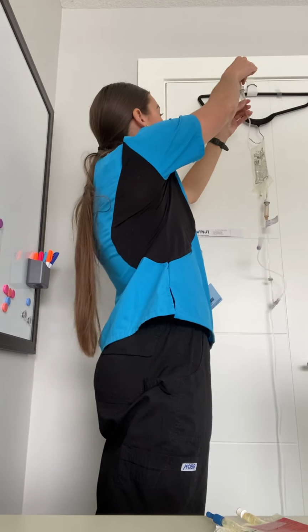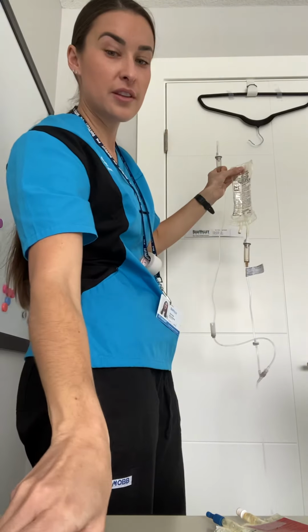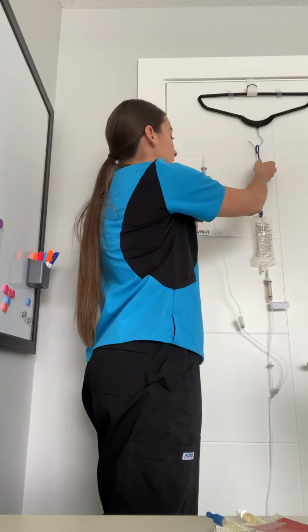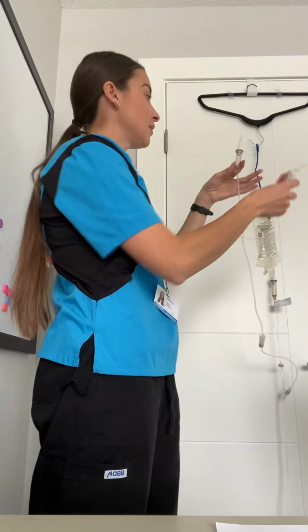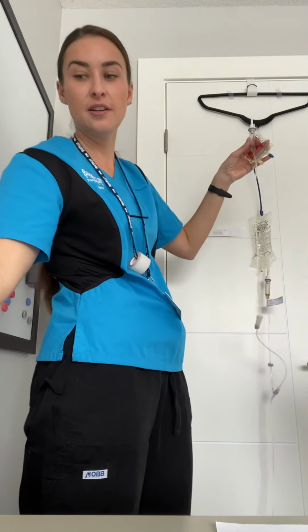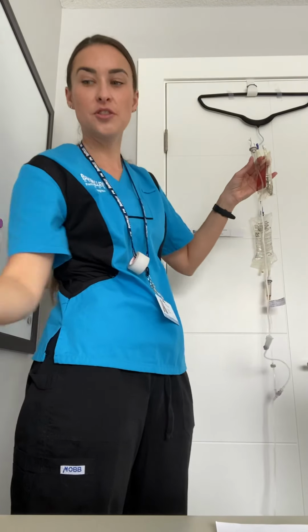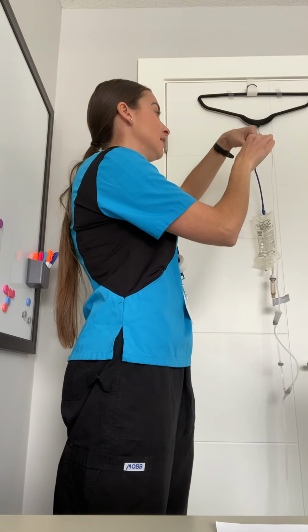And what we want to do is first move this bag so that it's going to be lower than the IV piggyback. So we'll hang that there. We have this line higher. And then what we want to do is keep this sterile, as well as the port to the mini bag sterile here. So we're going to open here and we have the mini bag here, also open there. And then we can spike the bag here.